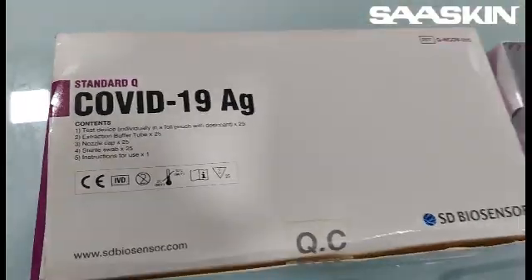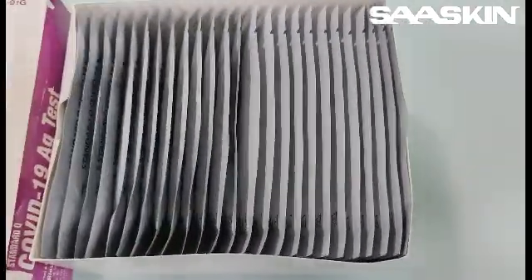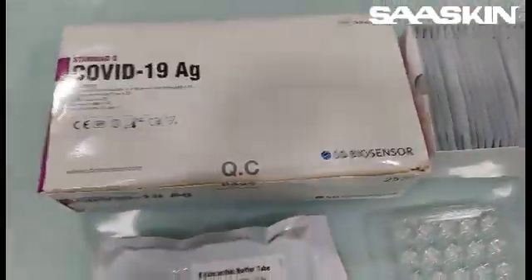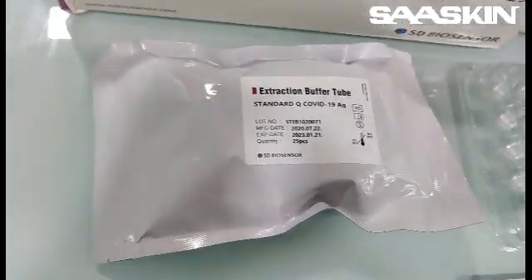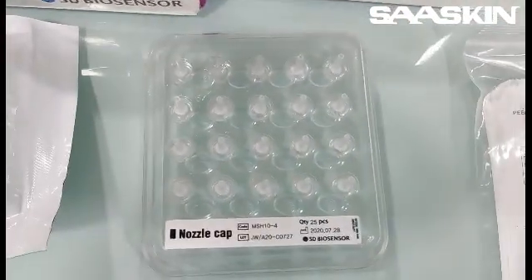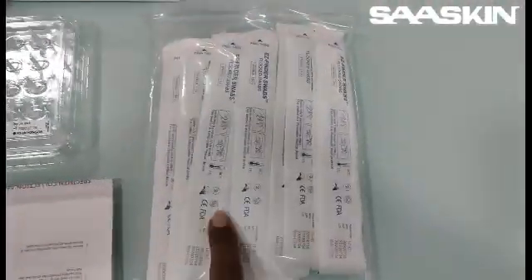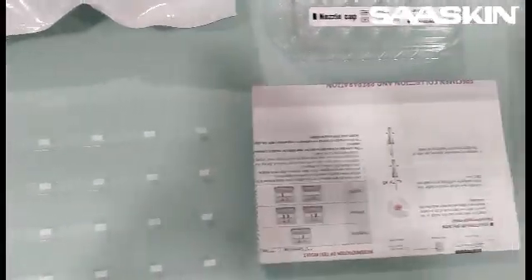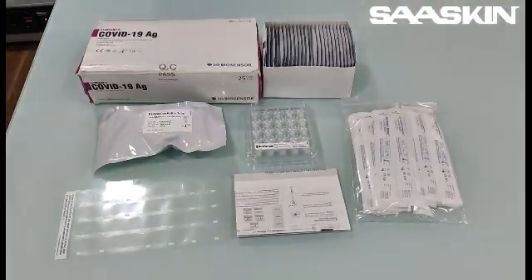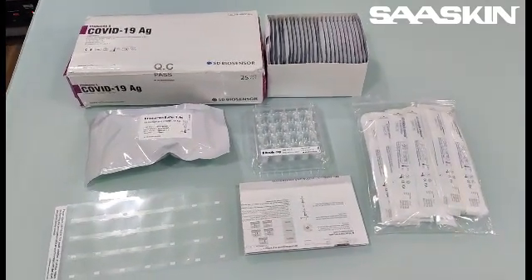Let me take you through the complete product. Each box will contain the test cassettes — that's the test device, 25 numbers pack. Next you have the extraction buffer tube, also in packed condition, containing 25 numbers of extraction buffer tubes. Then there is a nozzle cap, 25 numbers packed, and the sterile swap sticks, 25 numbers. You have the instructions for use — the instruction manual — and also an additional stickering. This is the total details of the test content in the standard COVID test pack.